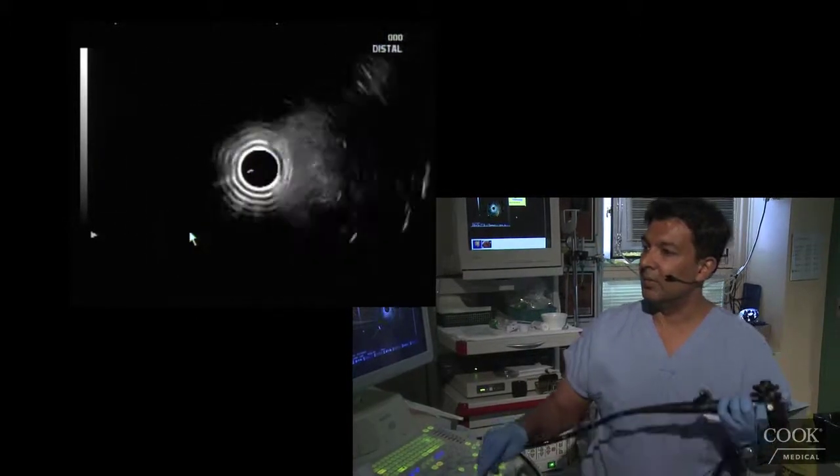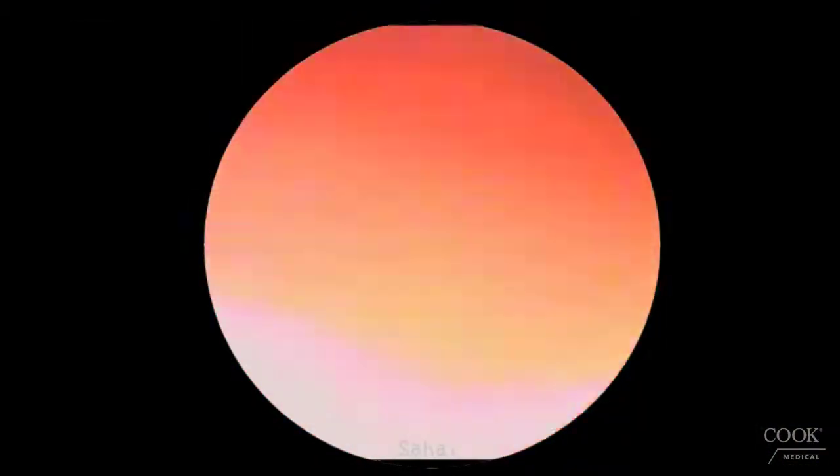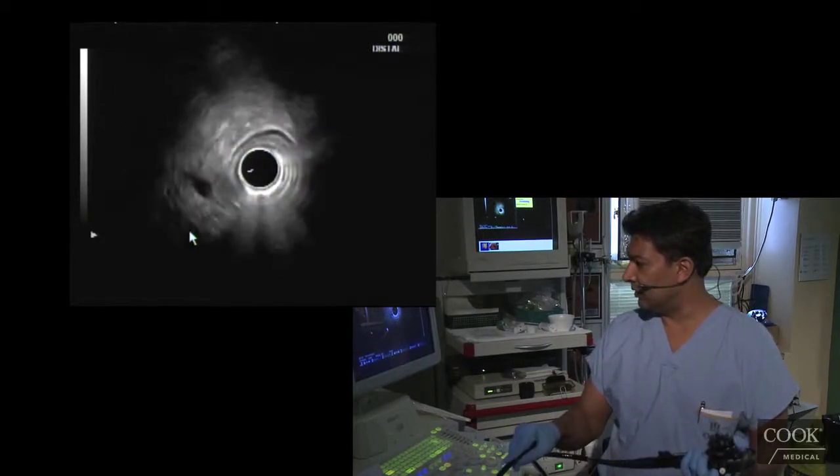So we're going to go into his bulb and look at his bile duct. Some people say the radial is easier — I disagree with that. I think the people who say the radial is easier are just not comfortable with the linear. Once you learn how to use the linear, there's no difference.